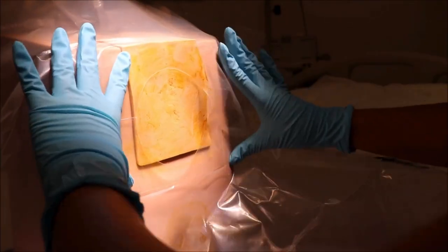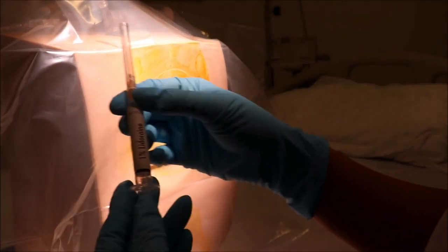The drape is not supplied separately from the epidural kit. If it becomes contaminated, you will need to open a new kit. Take your time to position it correctly. Inform the patient that you're numbing the area and ask them to remain still.